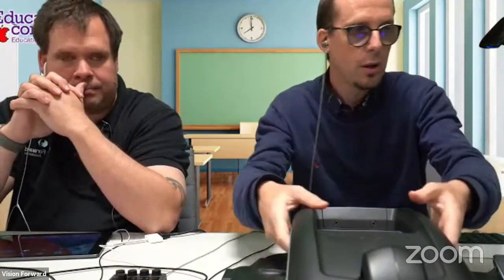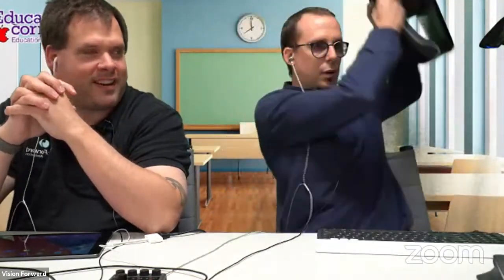But yeah, the Reveal 16 is basically very similar. The main benefit: larger screen, higher quality camera, more magnification, but heavier and less portable. Yeah, for sure. Okay, let's move that off. We're kind of running out of time because I want to get onto you, Corey, as well.